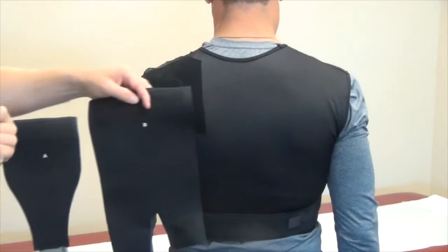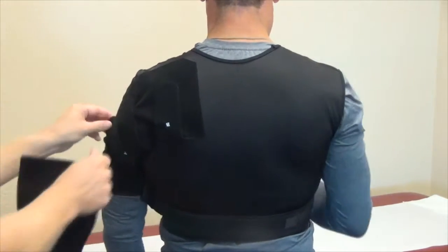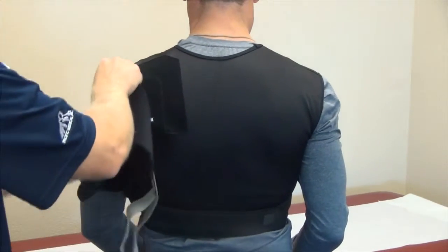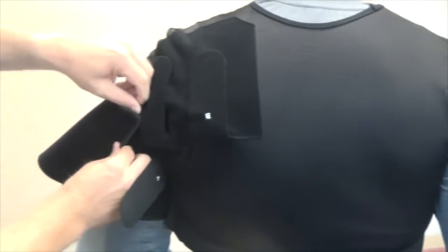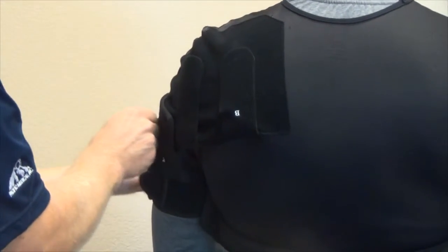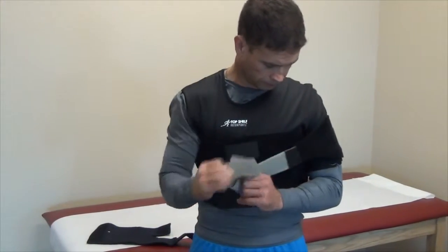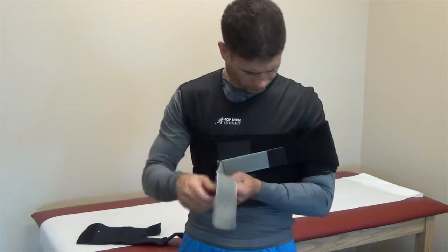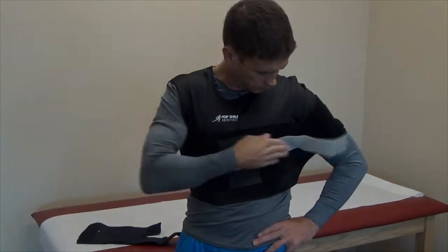The accessory strap labeled A is applied to assist in preventing external rotation. With the arm in the neutral or internally rotated position, demonstrated with the hand on the hip, affix the A accessory strap to the back side of the brace directly over the area with the corresponding letter, and secure it in place with the hook loop strap that is secured to the main garment. Draw this over the affected shoulder and lace it through the D-ring with the gray loop — gray strap to gray loop.